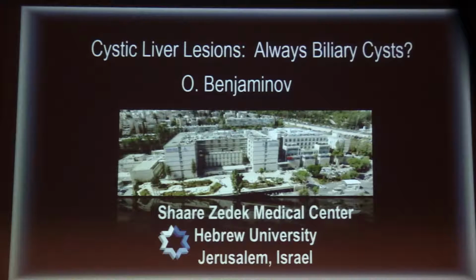Okay, thank you. So liver cysts comprise a large list of pathologies. They may be simple, they may be non-simple. Most of them in the liver are from biliary origin, but I will concentrate on those which are non-biliary.